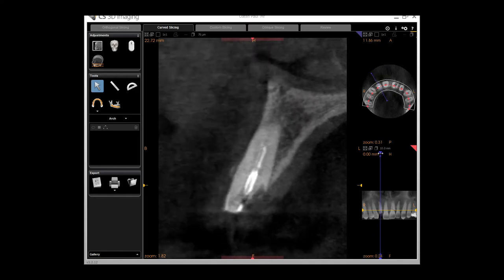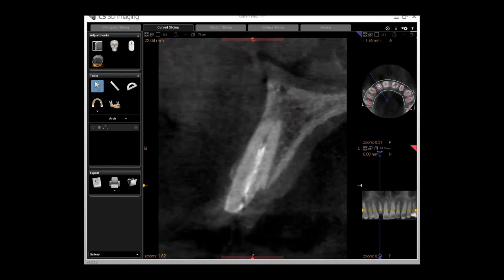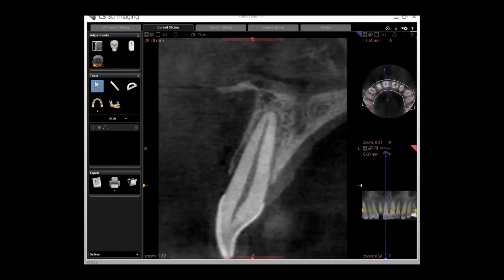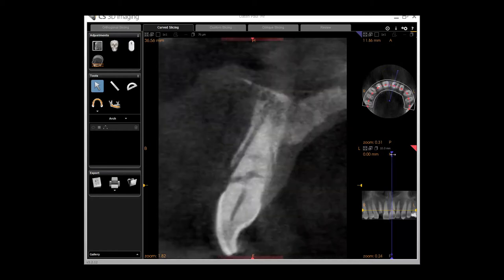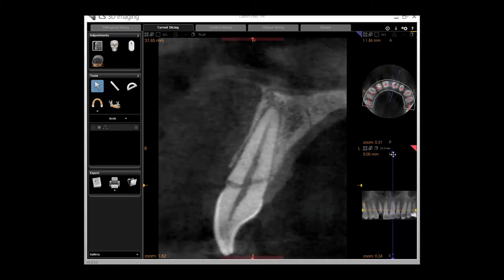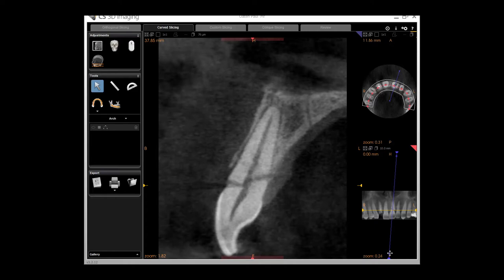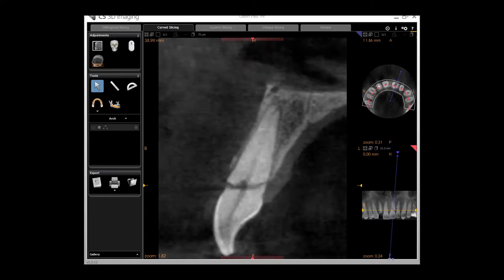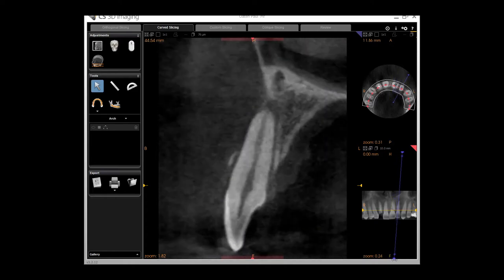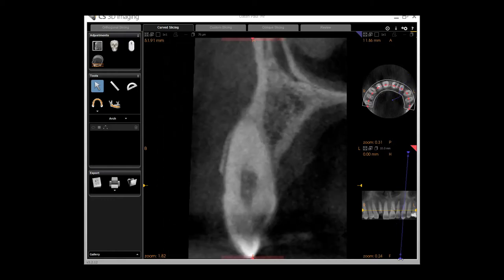This is me tabbing through the incisors in the upper anterior region in the panoramic view. Remember the measurements in this view are slightly less accurate than in an MPR or orthogonal view, because it is not a true slice. I can also change the angulation of the scan — there is a second tab on some of the slice lines which allows me to change the orientation of the scan. That is very useful particularly in upper anterior regions like this.